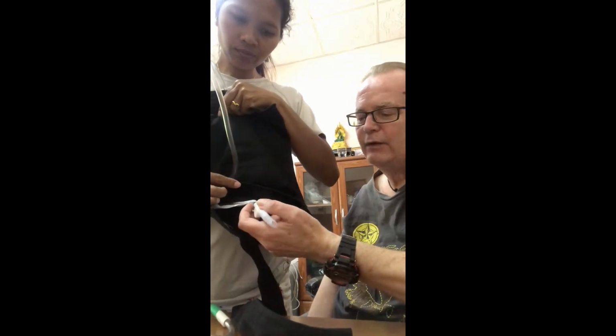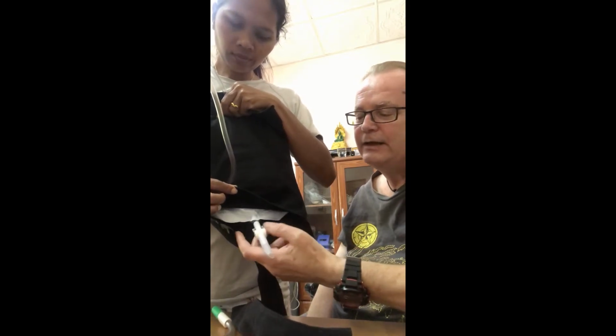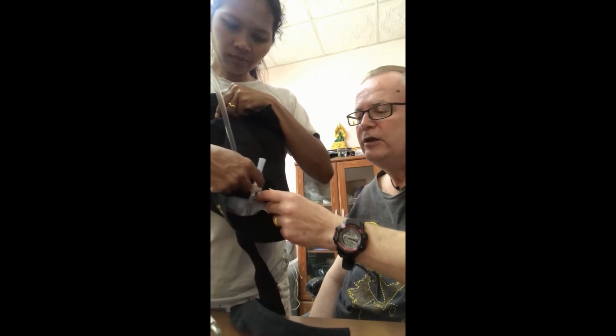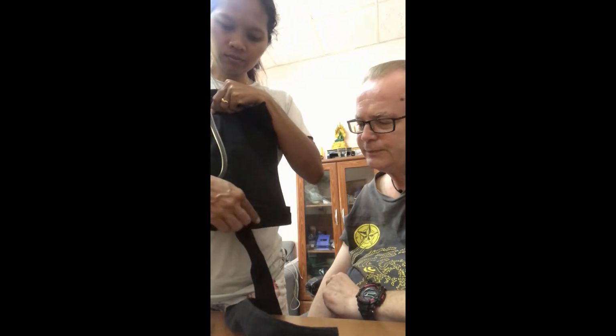Okay, so there's that. And then at the bottom, when you want to empty it out of the bottom, again there is material that you can grab hold of, and then you pull the outlet pipe out and empty, and then you just fold it up and you can put it back in again. So it's nice and neat, nice and easy to use.